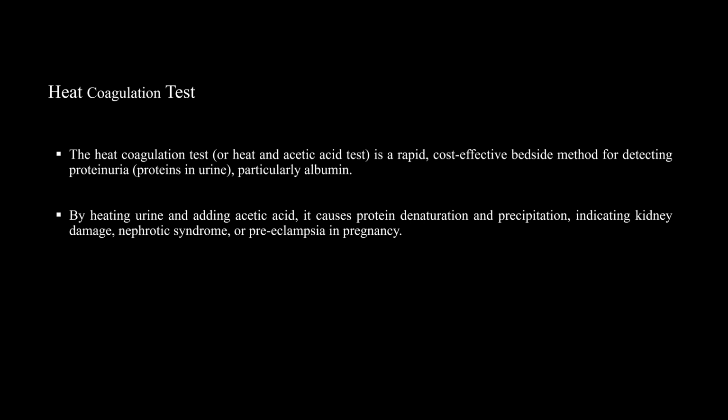Mechanism: the process involves heating the urine sample and adding acetic acid. Reaction: this causes protein denaturation and precipitation, making the protein visible. The clinical example of a positive result may indicate kidney damage, nephrotic syndrome, or pre-eclampsia during pregnancy.